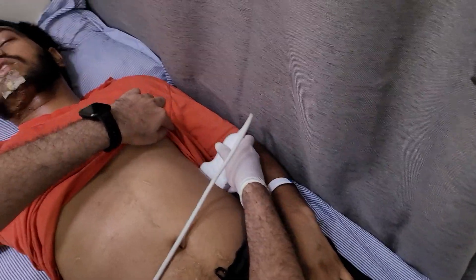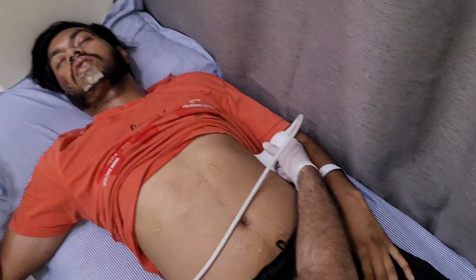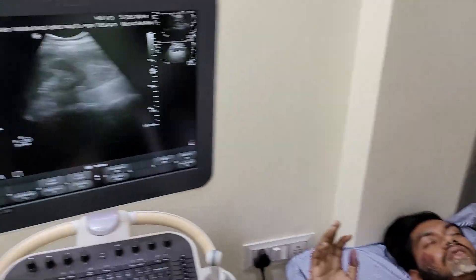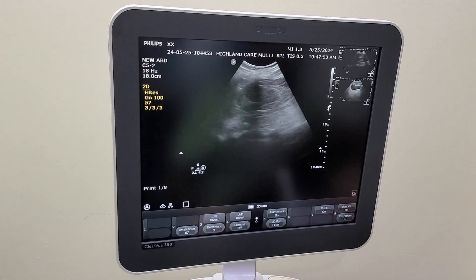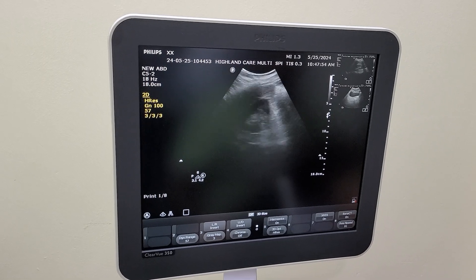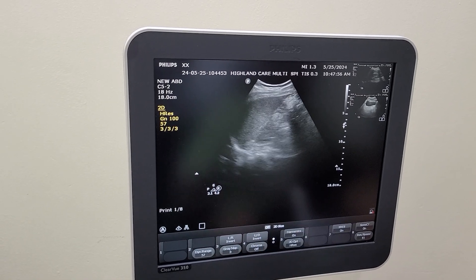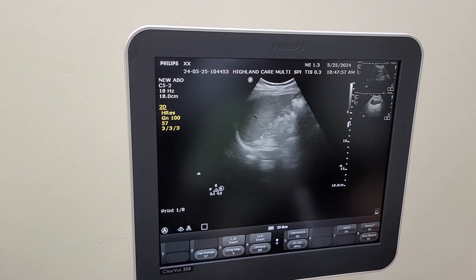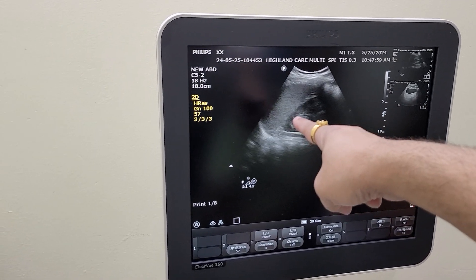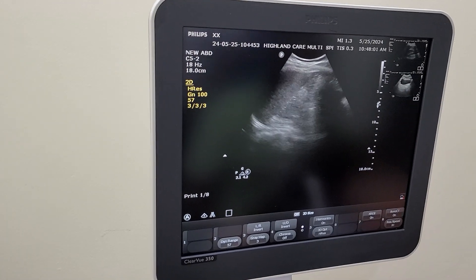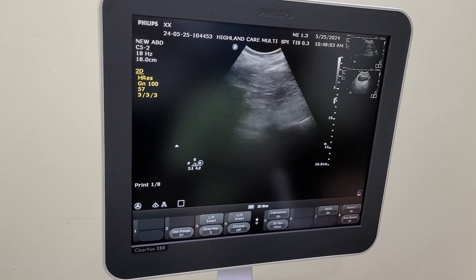We will now be focusing on the SRP — the splenorenal pouch. You can see we can get the shadow of the kidney also there. This is spleen, this is kidney, and no significant collection is seen here either.